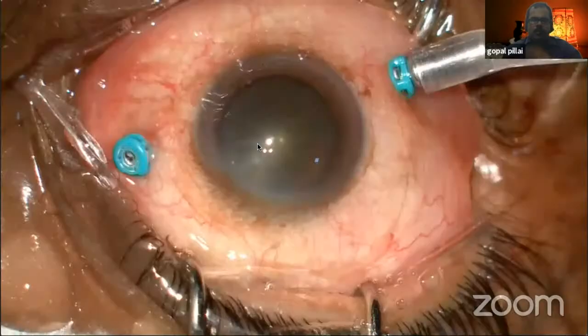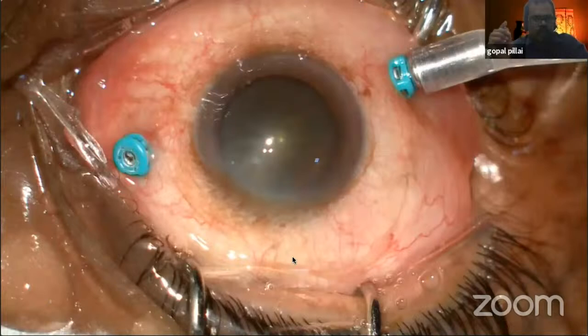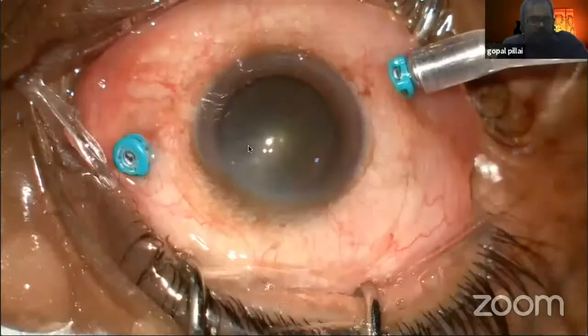And that also can be done with this. Now, with the 25 and the 27 cutters, since the opening has moved closer to the tip, with a high cut rate, probably you can shave it. But if it is very close and we are in a critical region, I have a sharp spatula also, as well as a blunt spatula. The sharp spatula helps significantly to find the cleavage plane through which you can initiate the shaving. So once you have that initiation, the suction will pick it up and it will go on.